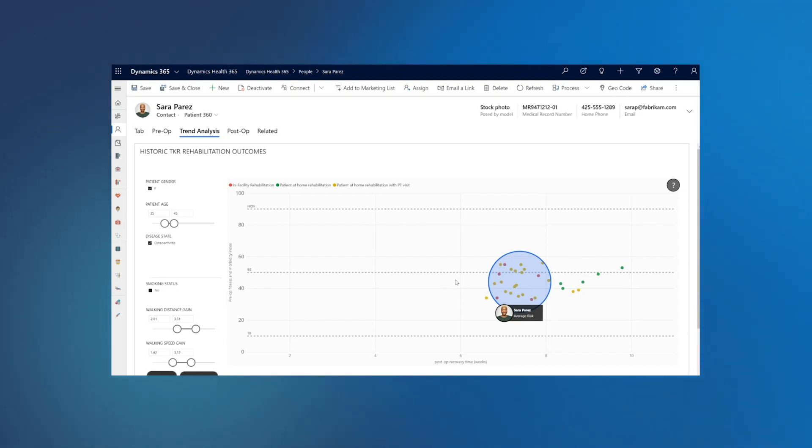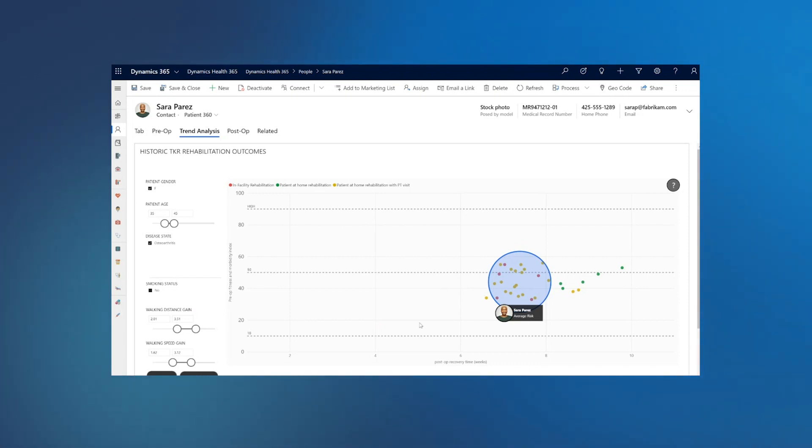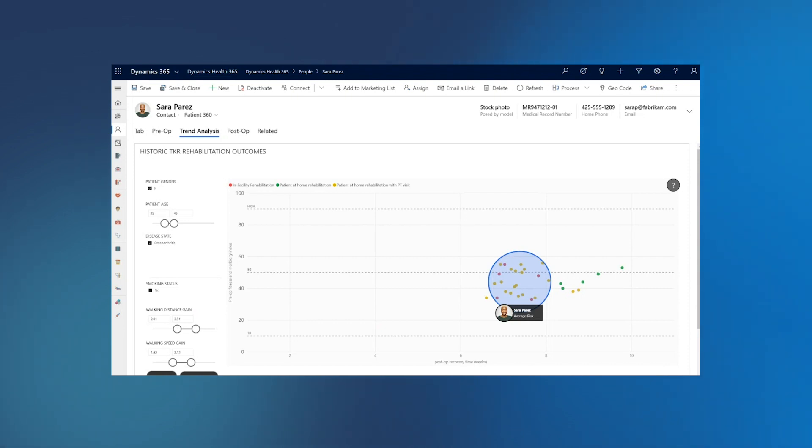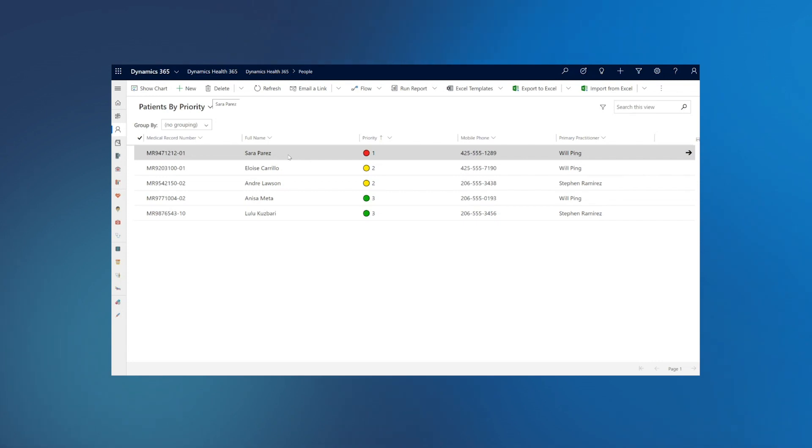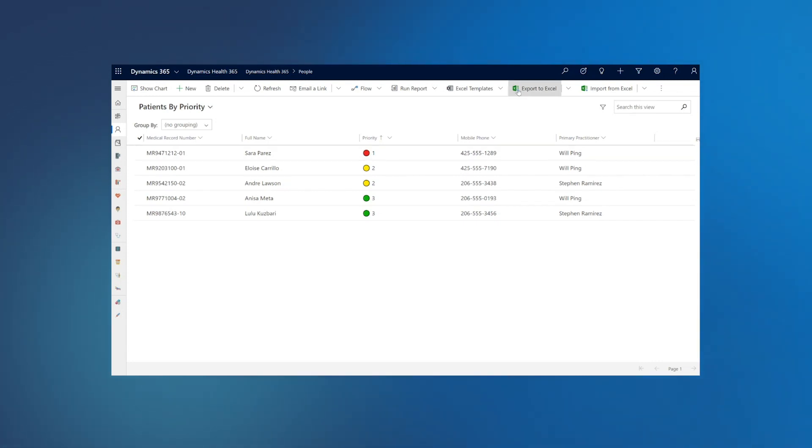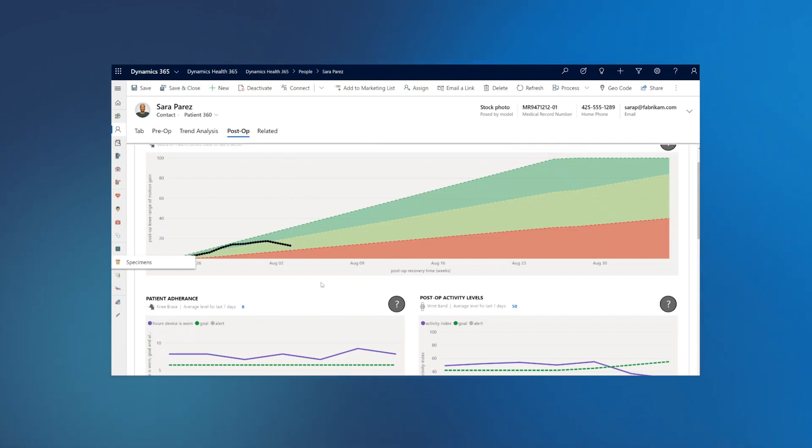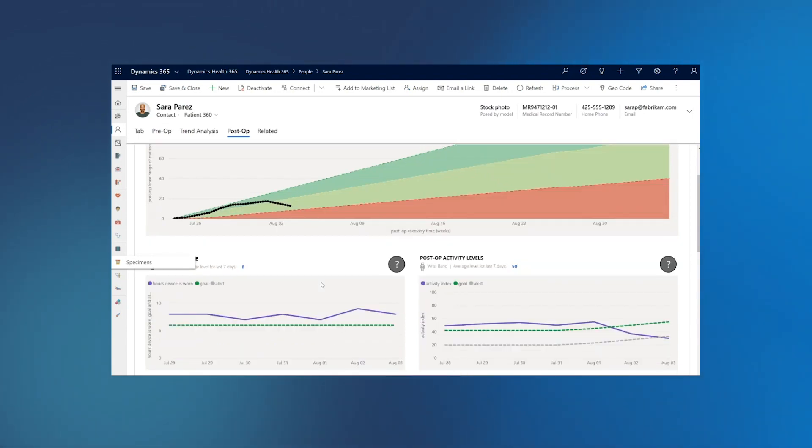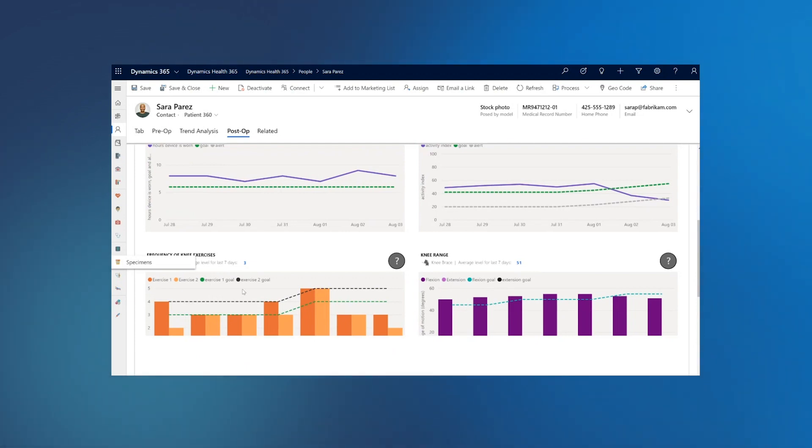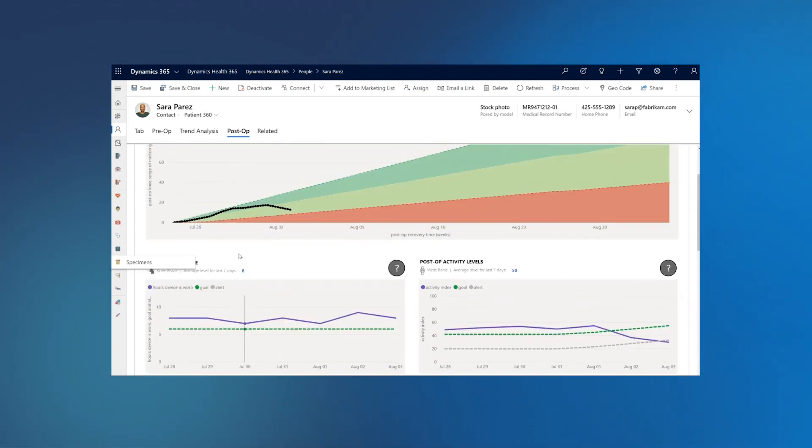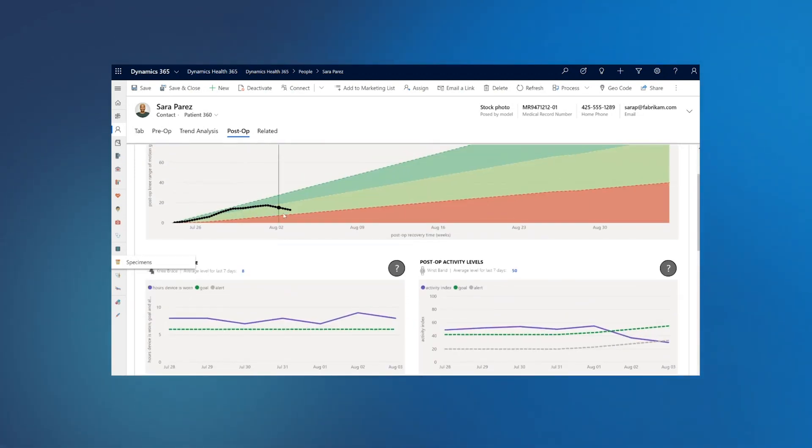Now the data starts flowing in real time in this system and the system also provides notification capability if Sarah needs attention. This is an example where care team can get notification if Sarah is not following her regimen or needs attention. And care team can go and look at her data. The care team can see her extension and flexion data as compared to the goal, can see her exercise level data, and indeed Sarah is not following her trajectory path.